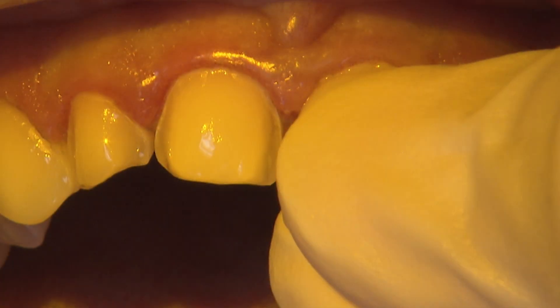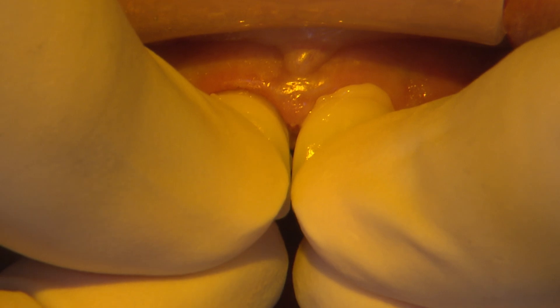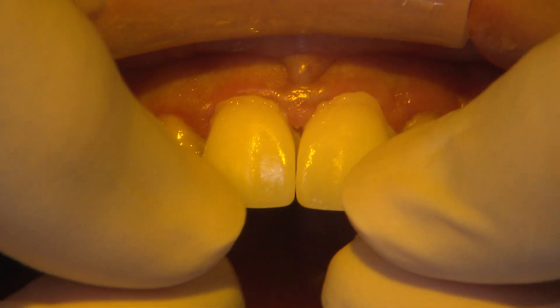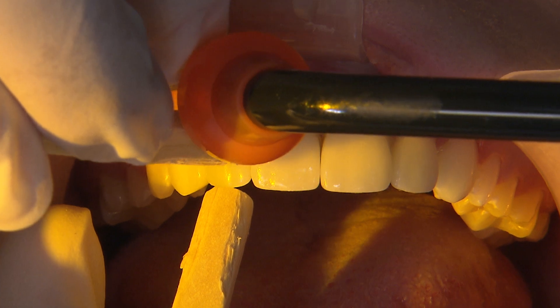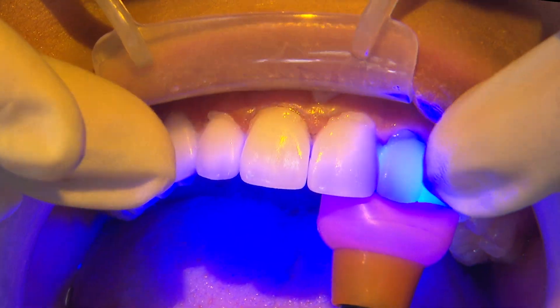We deliver these veneers with Kerr NX3 light cure cement so I can seat all of the restorations down at the same time. I apply lingual and apical pressure using bite sticks while my assistant tack cures each veneer down.